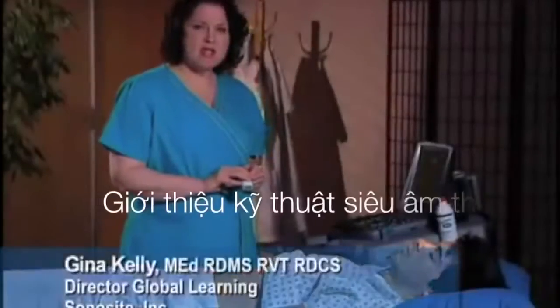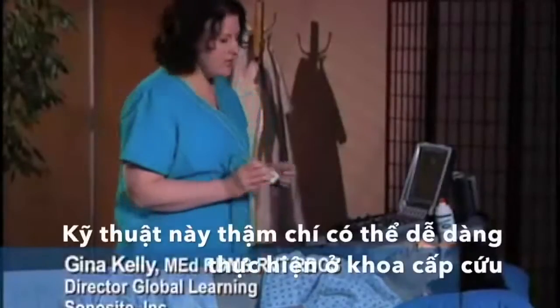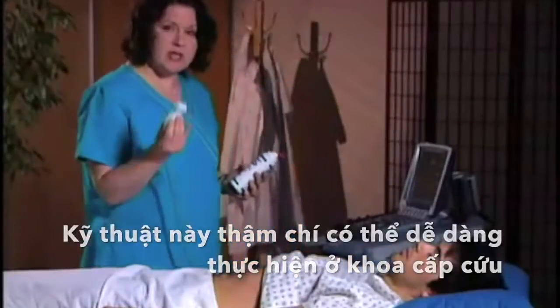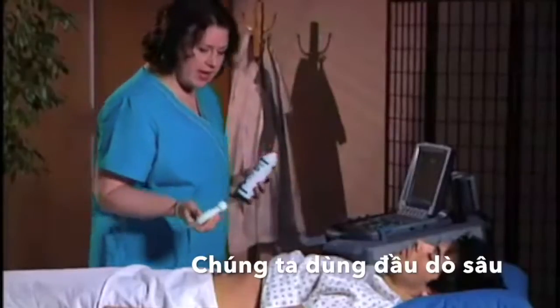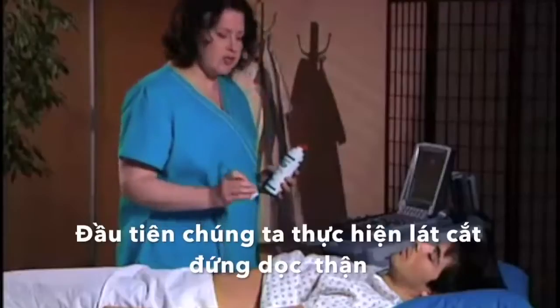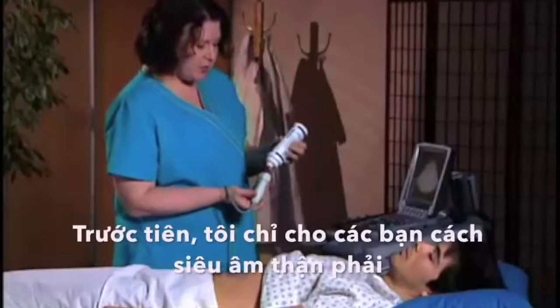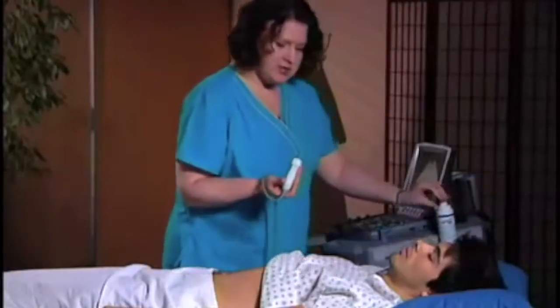Another examination you can do in the ED is the evaluation of the kidney for nephrolithiasis. This is a relatively easy examination to do. We're going to use the phased array transducer, your all-purpose ED transducer. The first view is a sagittal view of the kidney. I'm going to start on the right side, but I will do both sides to show you how to do an evaluation on both sides.